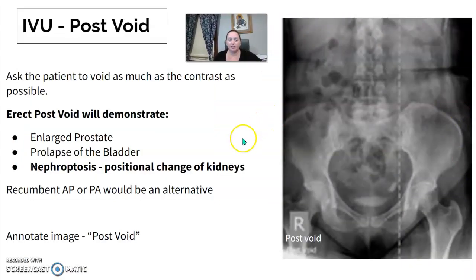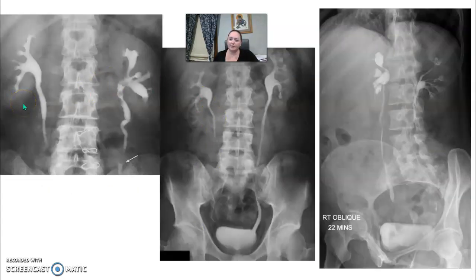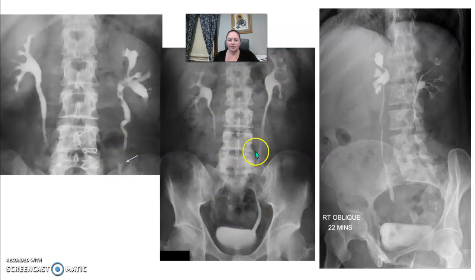For the post-void image, you ask the patient to go to the bathroom and void out as much contrast as they can. Most locations take a post-void KUB; some request it to be upright to evaluate for prolapse or nephroptosis — a positional change of the kidneys. Make sure to document it as the post-void. On IVU images you can see contrast highlighting the kidneys, with arrows pointing to areas of possible stones. Ureters are seen draining into the bladder, and oblique images are annotated with the time — for example, 22 minutes.